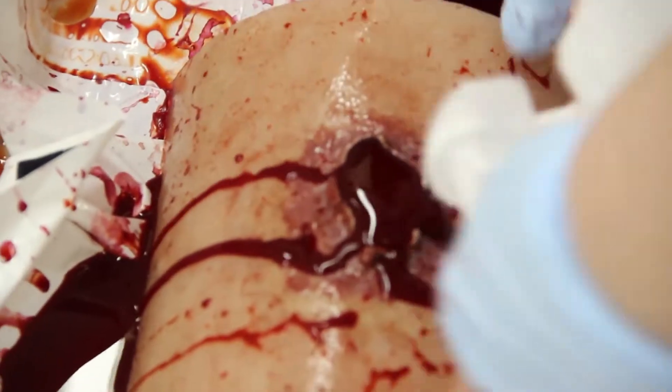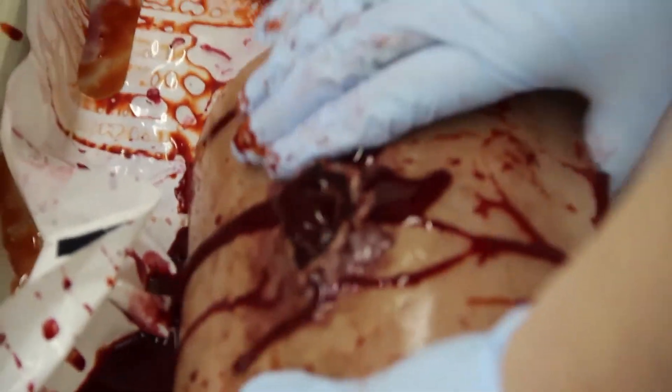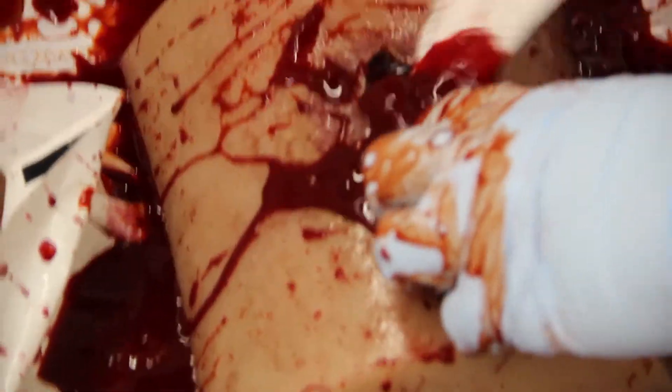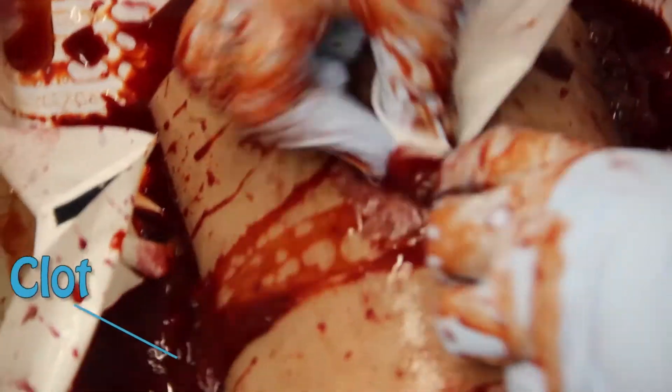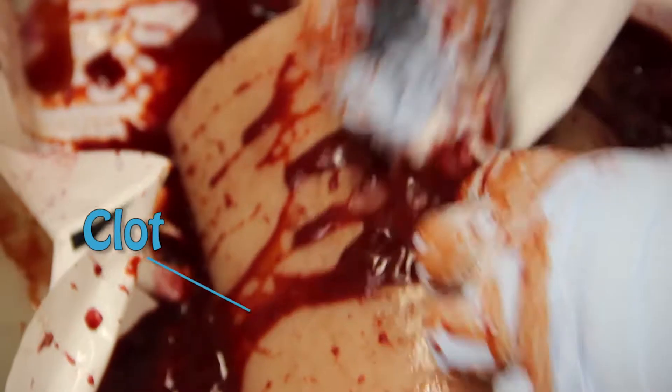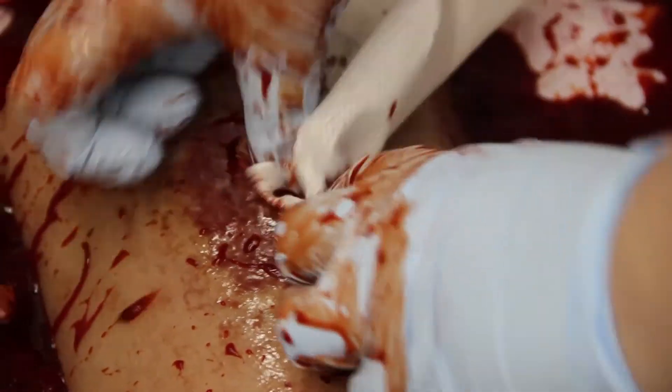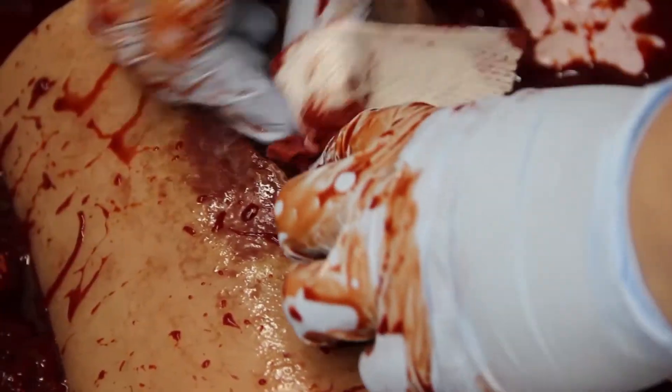This is just going to start squirting out. So if we were being realistic, this would look something more like flow. So I'm going to go with this gauze and start shoving — this is what we do, we pack a wound. What you want to do is start to see the clots come out — that's a good thing. Zach, you should be feeling a little bit of resistance right now. The more gauze we stick in here, the less flow there is and the more clotting occurs. As much gauze as needed.